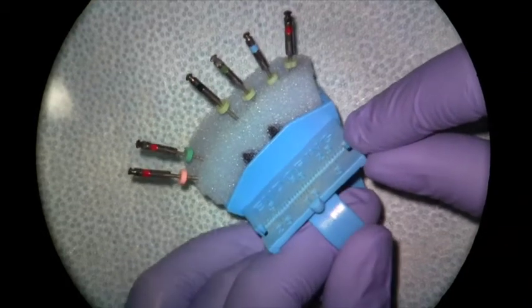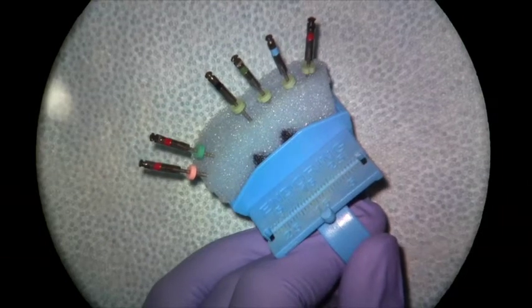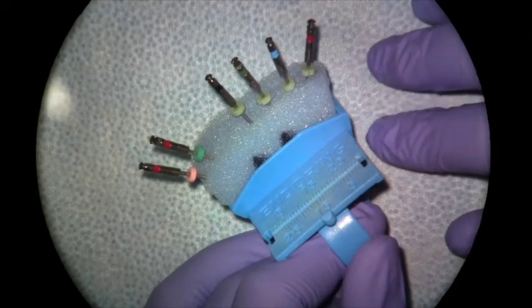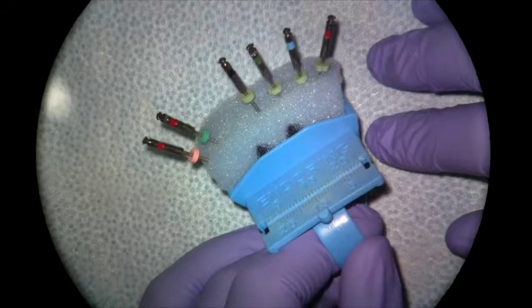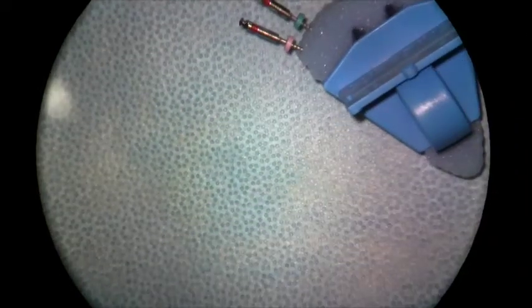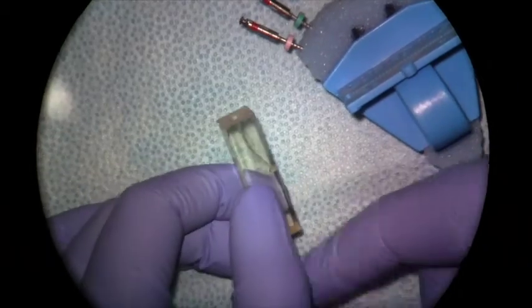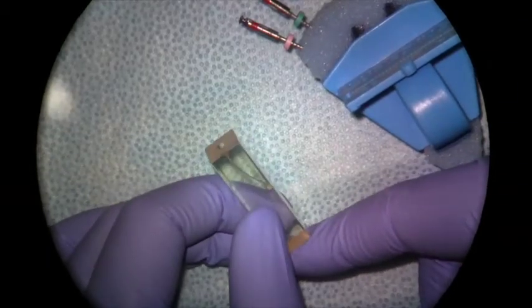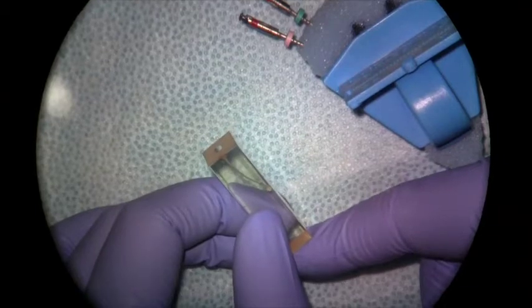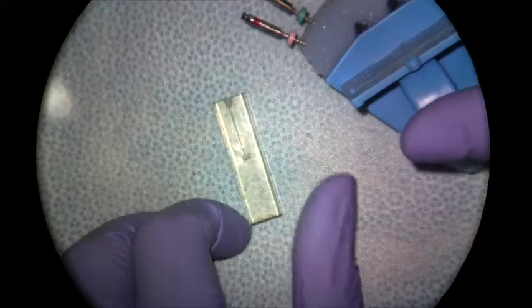I have them lined up here to do a 04 taper canal, which would be a small to medium size canal. Before we start using our rotary instruments — and I'm going to be using this on a plastic block today — we want to get our working length determined and a glide path created before we move to our rotary files, and we're going to do that using hand files.